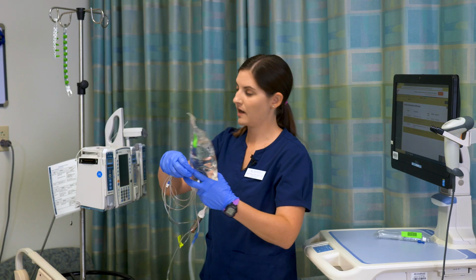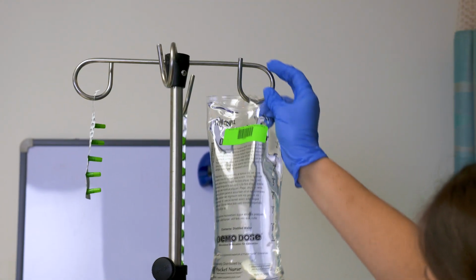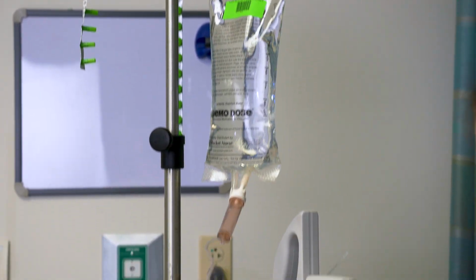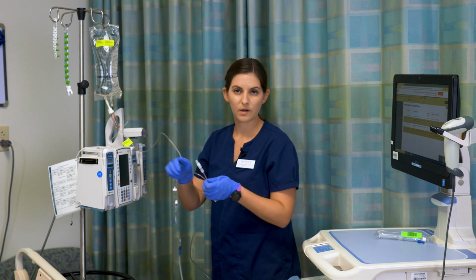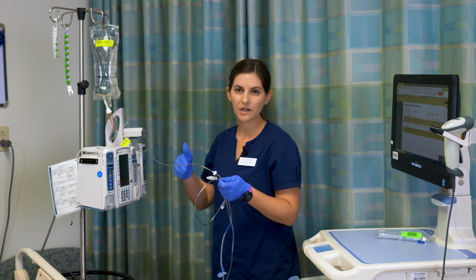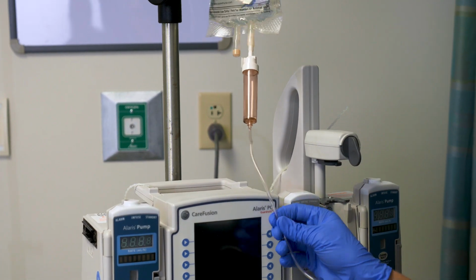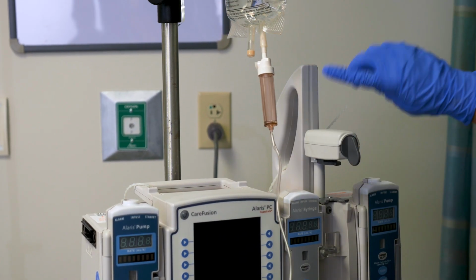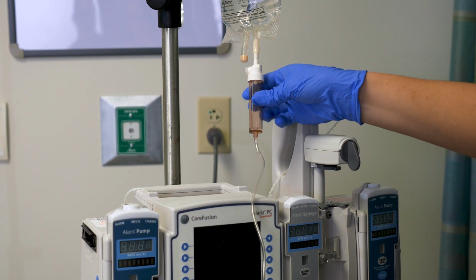I can then hang my bag on my IV pole. Next, you want to prime your tubing, which means you're going to get all the air out of the line. In order to prevent air bubbles, you want to fill the drip chamber. The drip chamber is this part right below the IV bag, and you want to fill it at least halfway.